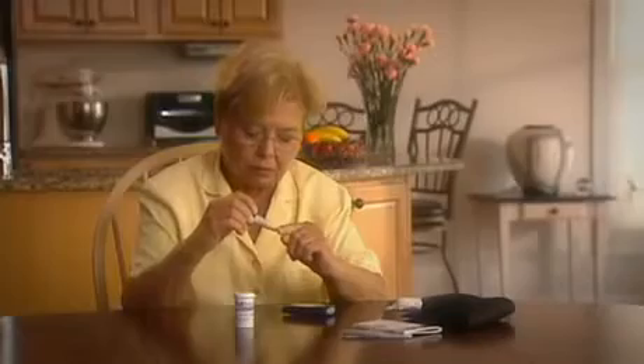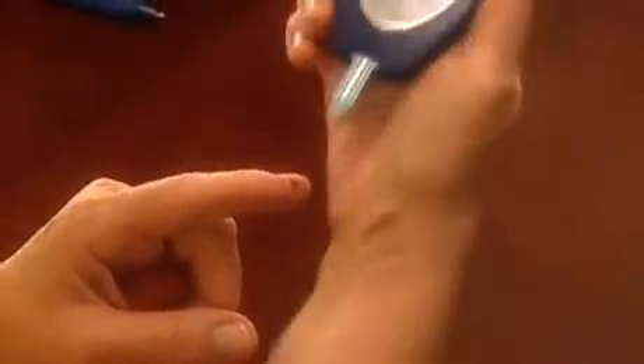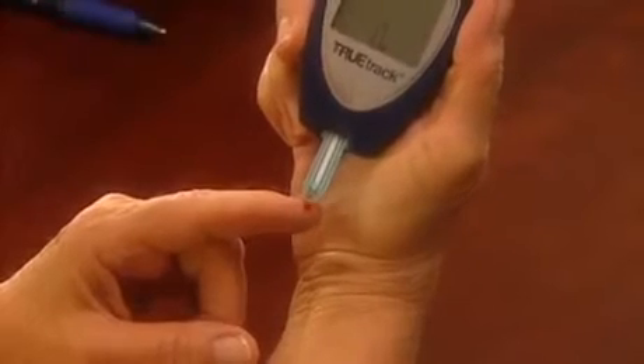Lance the side of the finger to obtain a blood sample. Allow a small blood drop to form. Then place the test strip sample tip gently against the blood drop and hold it there until the meter beeps.